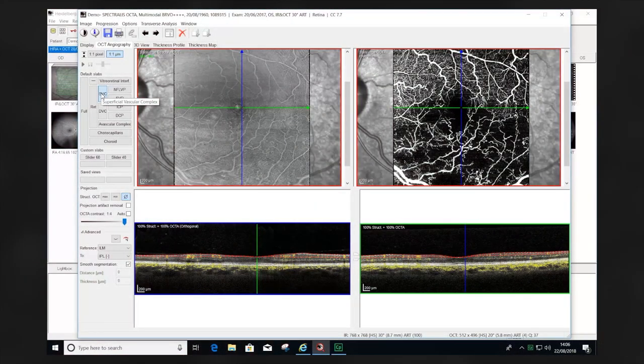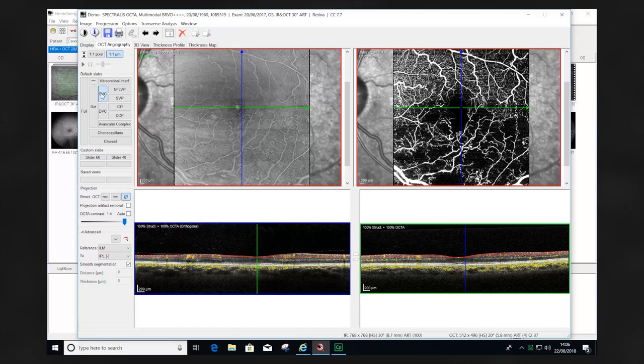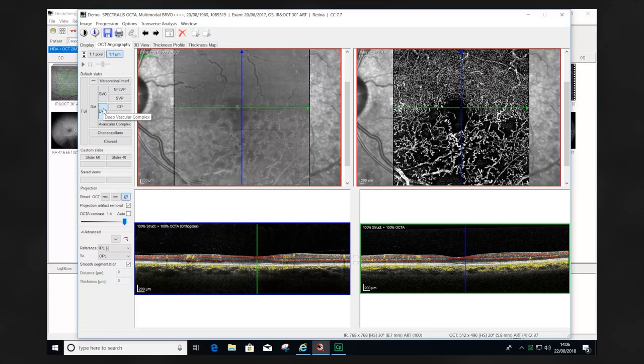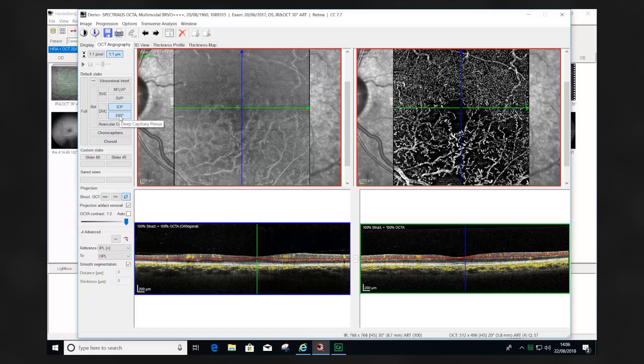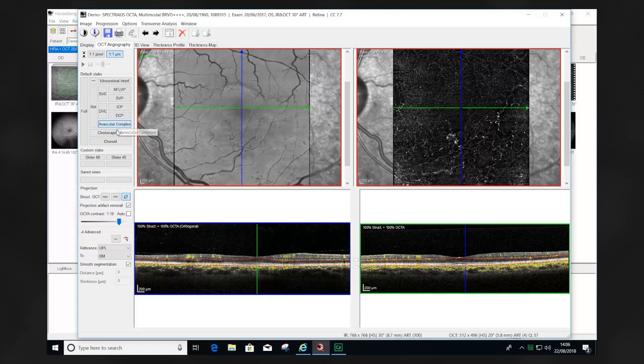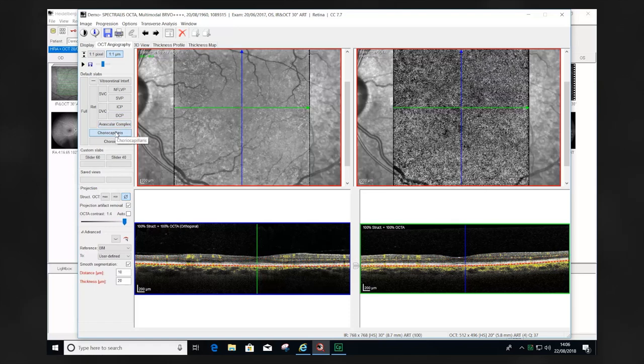Here we see an example of a branch retinal vein occlusion analyzed using the predefined segmentation. We've seen the superficial vascular complex and then the deep vascular complex. The deep vascular complex and intermediate capillary plexus are useful in analyzing the arcades. Furthermore, we look at the deep capillary plexus, then the avascular complex, the choriocapillaris, and then choroid.